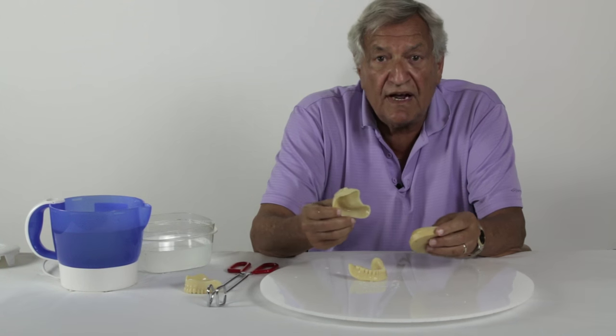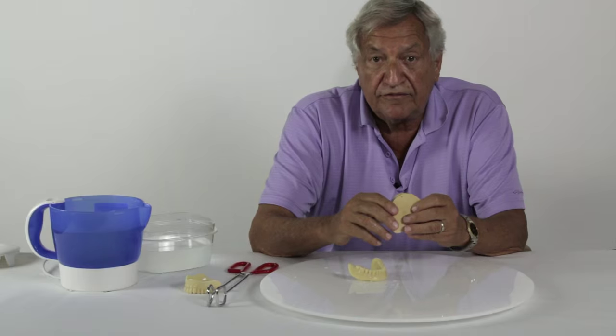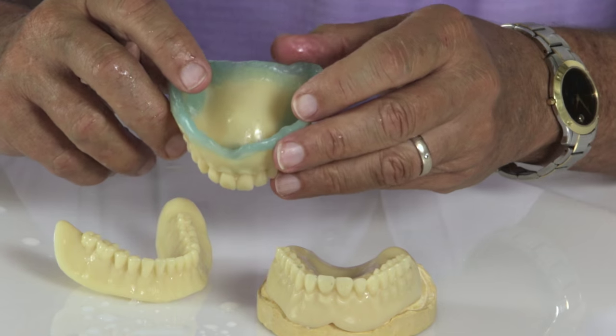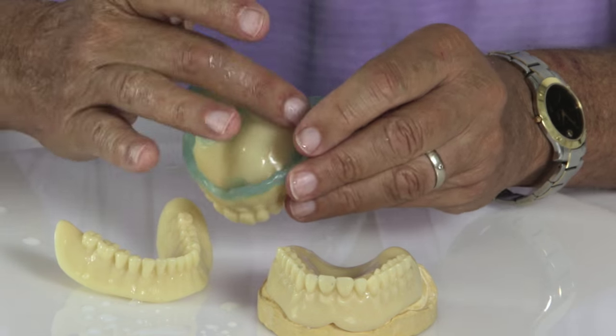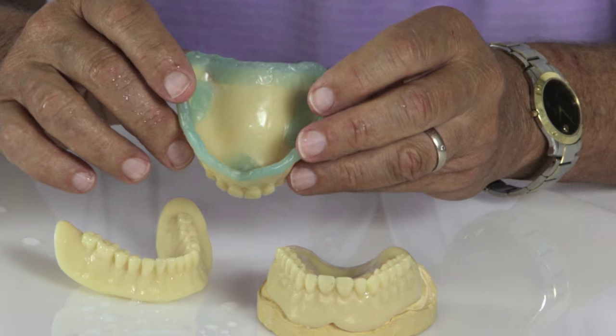Once the trays have been customized, you're dealing with a conventional final impression. You can border mold with any material of choice. Basically, you're going to take two custom impressions. There are also tissue stops put in there, which can be used to keep an even thickness of material.